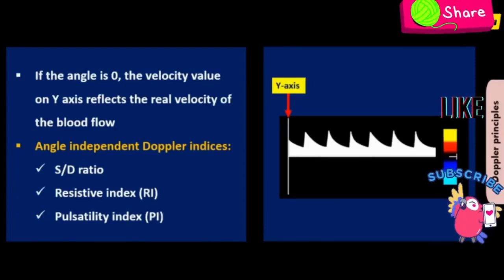The most useful Doppler indices are the SD ratio, resistive index, and pulsatility index. The pulsatility index gives the maximum of hemodynamic information. These indices are independent of the angle, so the values do not change significantly when the angle changes.